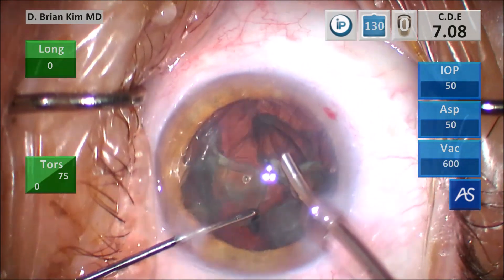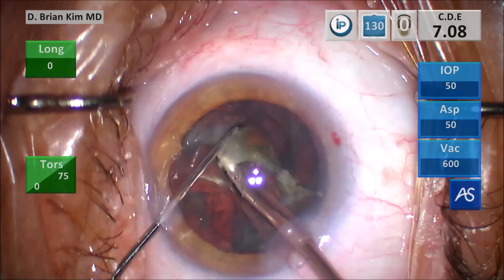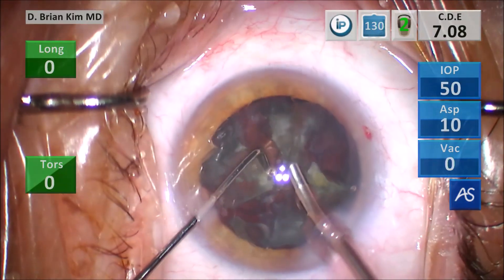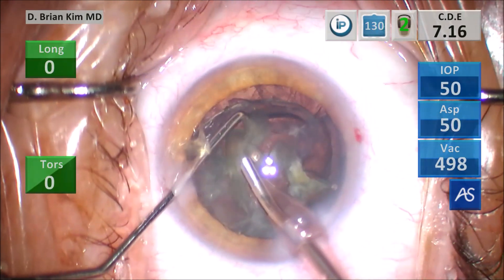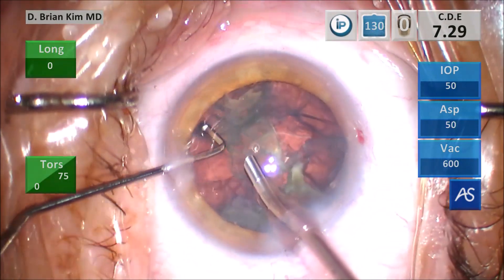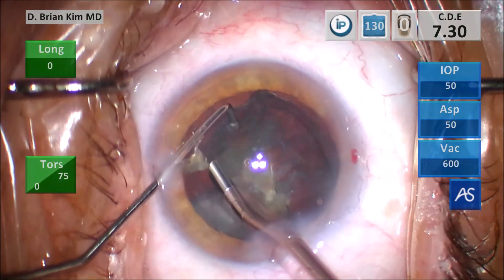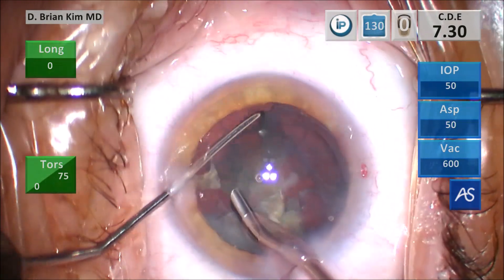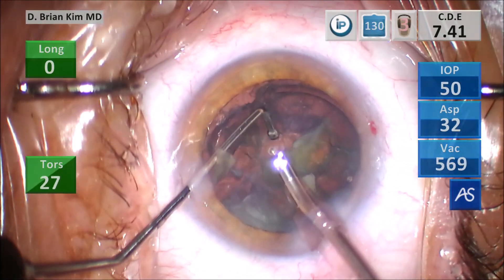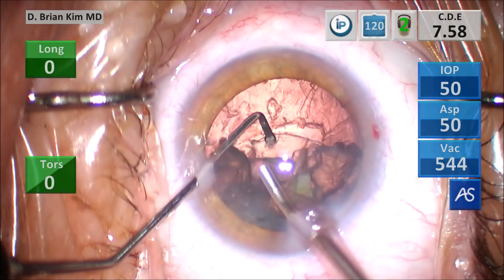I'm very carefully and methodically disassembling that fourth quadrant, hooking the peripheral lens with the chopper, fracturing the lens pieces into smaller pieces. There's a little attachment on the posterior aspect, but because I'm just using irrigation, I'm able to carefully position the two instruments very close to the posterior capsule — I don't care because I'm not using vacuum. I can position the lens such that the two instruments are around it and crush it with mechanical forces. A very controlled, methodical way without high vacuum to disassemble and then emulsify the lens pieces.